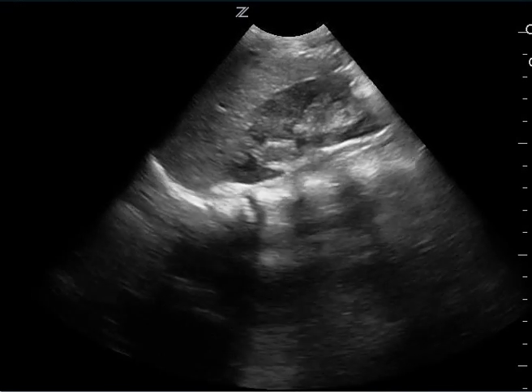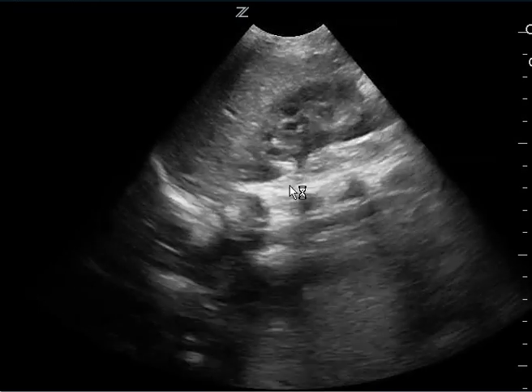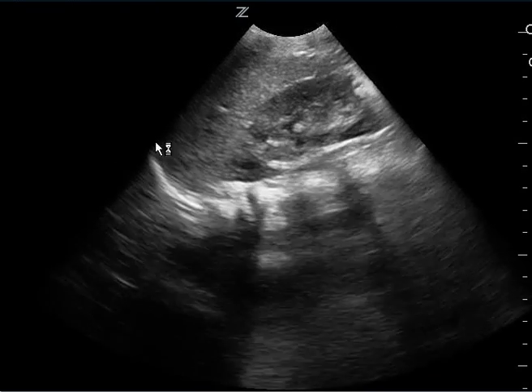You do this perfectly on the left upper quadrant. You can see the spleen here, the kidney there, the spine, and then the diaphragm there.